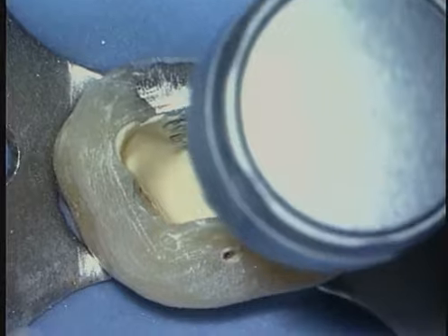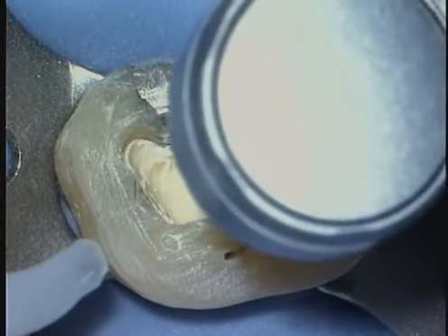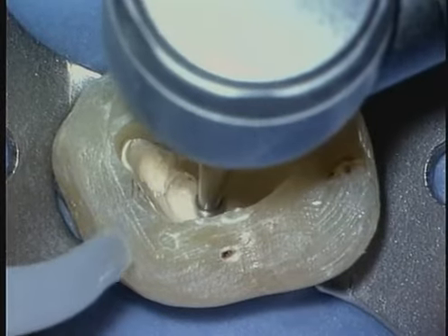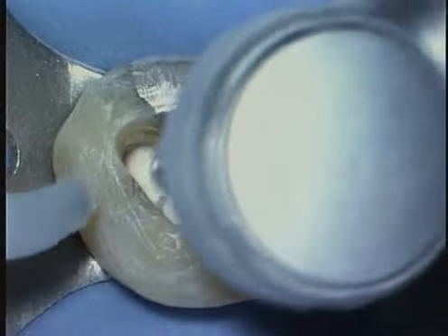Picking the access up in progress, you can see the same kinds of attention to detail needs to be followed from case to case. We need to disassemble and remove all the previous restoratives. Getting the restoratives out of the tooth is going to give us the vision we're going to need to begin to chase for extra canals.